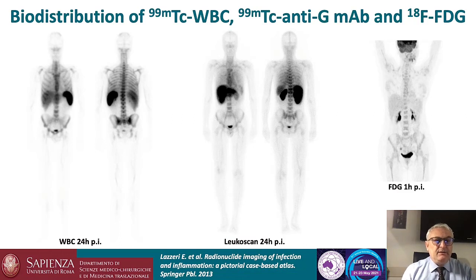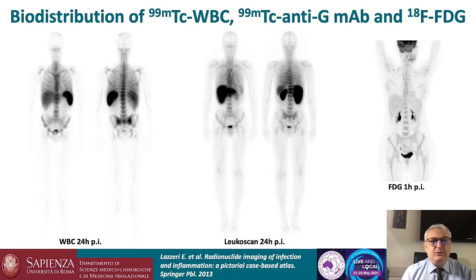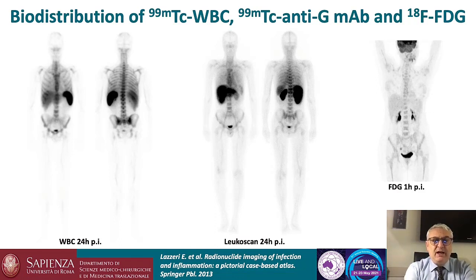Here you can see the whole-body scan of a patient injected with white blood cells at 24 hours, a patient injected with a monoclonal antibody fragment Leucoscan at 24 hours, and a patient injected with fluorodeoxyglucose at one hour post injection. For white blood cells we have more uptake in the spleen and bone marrow than liver. For the antibody peptide we have more uptake in the liver and kidneys and bone marrow. For FDG we have an optimal biodistribution that would suggest its use as a standard method for imaging infection.